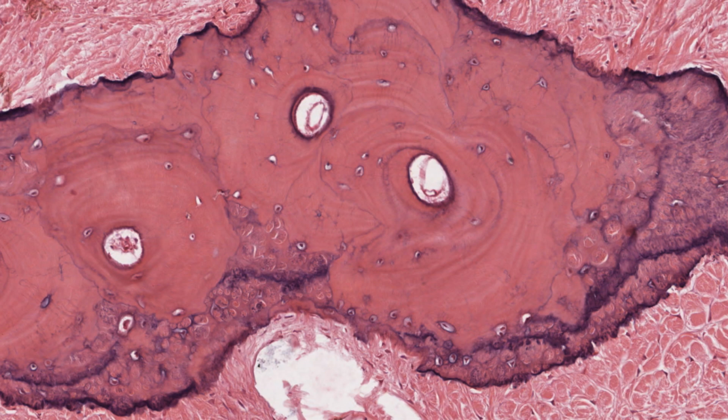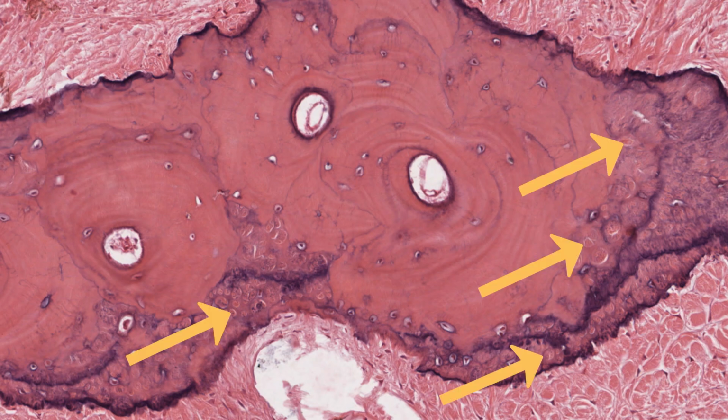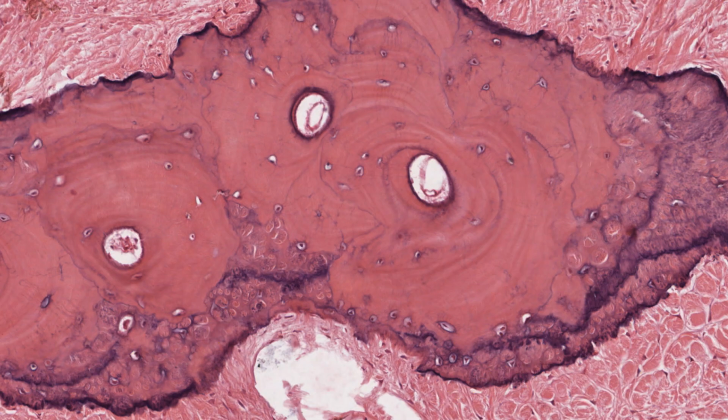The bone tissue looks somewhat strange because its outer border is riddled with Sharpey's fibres. Also, it's sectioned parallel to and just below the surface of the bone. For some reason, the lamellae near the surface have excessive amounts of ground substance and therefore a variegated bluish appearance.